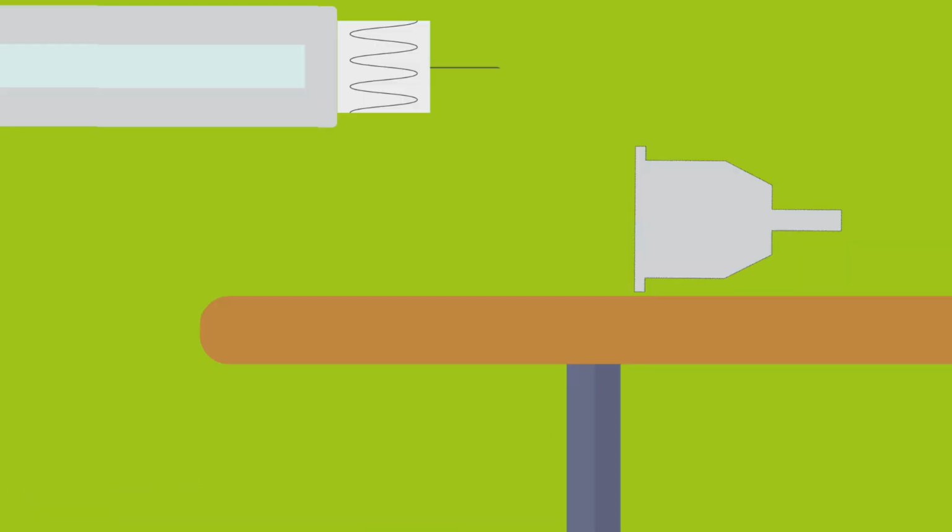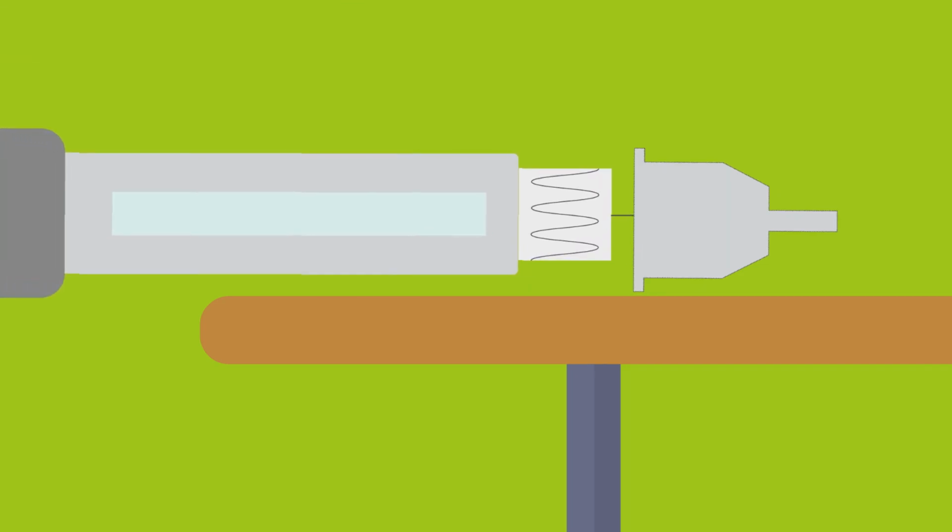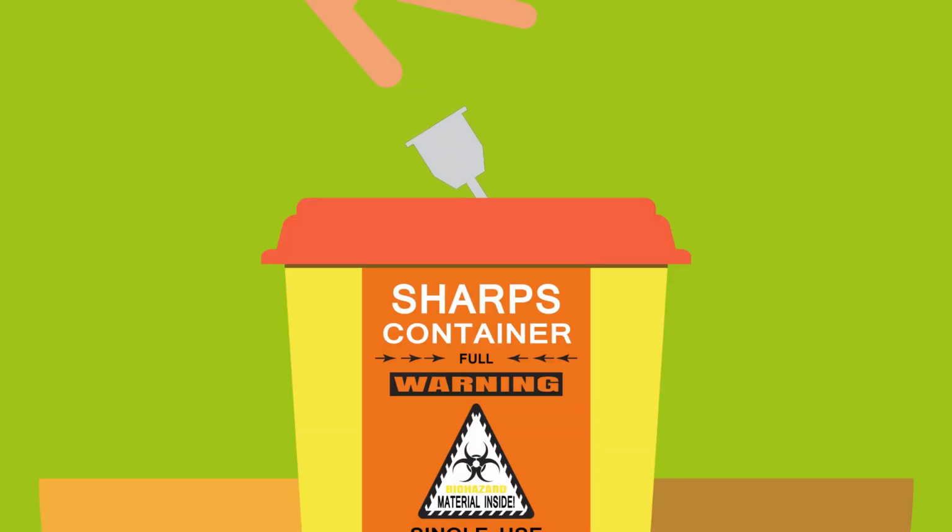To remove an insulin pen needle, lay the injection pen down on the table and move the used needle into the lid. When fully enclosed in the lid, secure the needle within the lid, unscrew the needle and place it in a yellow sharps box.